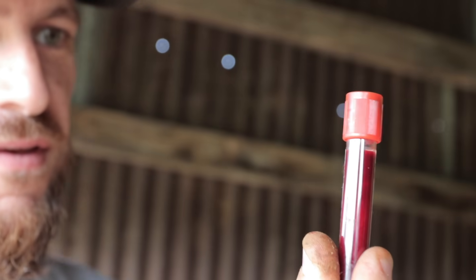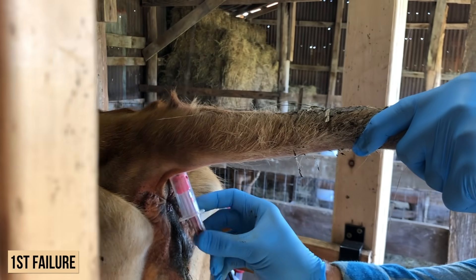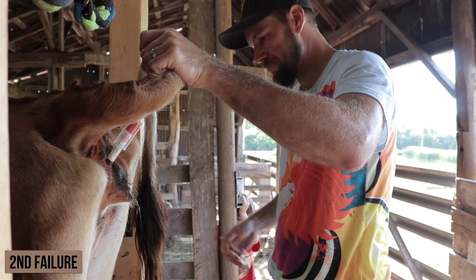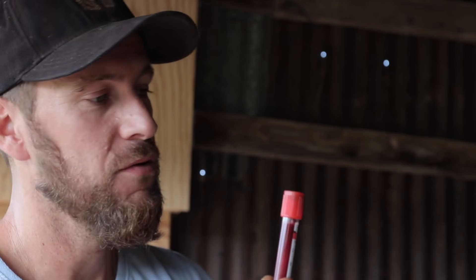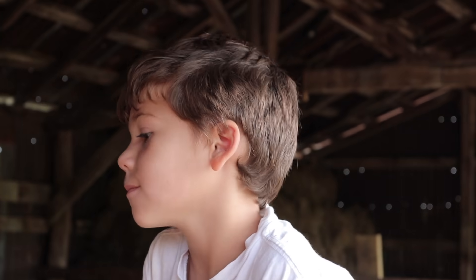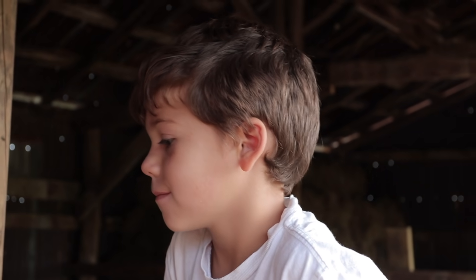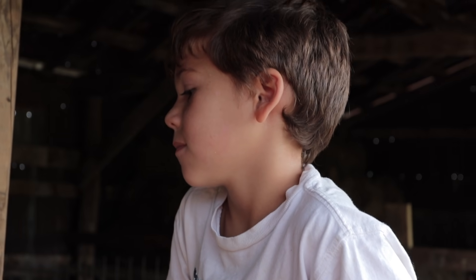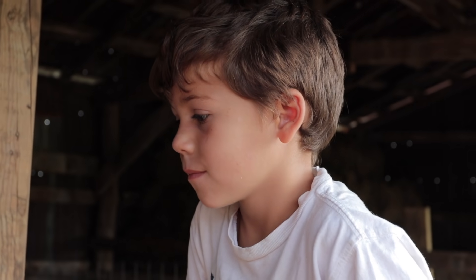Oh my goodness, that was a challenge. How many times did it take us? This is our third day trying it. We gave up after the first two days because we couldn't hit the vein and lost suction. Please be pregnant because I don't want to have to do this again. What did you think - is it scary? Is it fun? Is it exciting? It's scary. But do you like watching Daddy work at the cow? Uh huh.